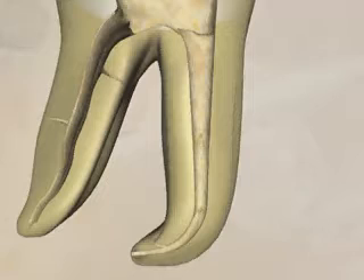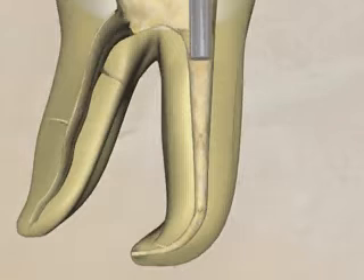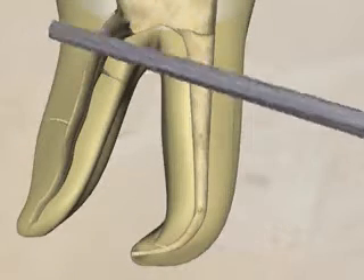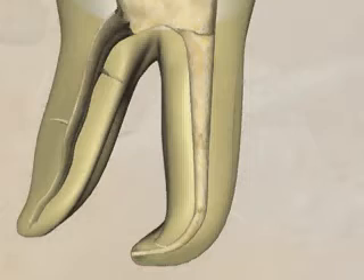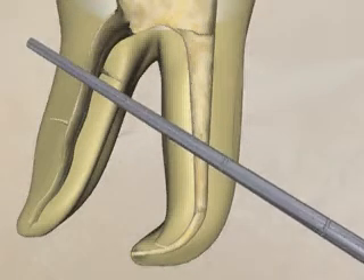Pluggers are fitted into the canal space in succession. In this animated example, the large plugger reaches a few millimeters into the canal space. A smaller plugger goes several millimeters further to mid-root in this example. The smallest plugger should get within 5 millimeters of the working length.